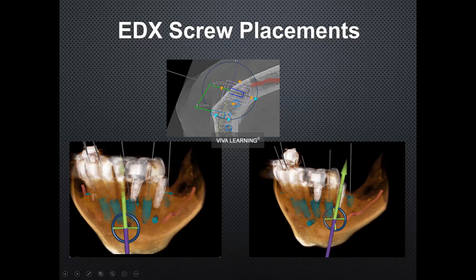And in this case, as I remember now, I just snapped a quick X-clip on. I did the X mark to register him with that, so I could just drill my 2 holes to start with for the EDX screws, mainly because this was close to a nerve and we had 2 implants up here to deal with. So we wanted those to be ideal, so I was able to guide those initial holes.